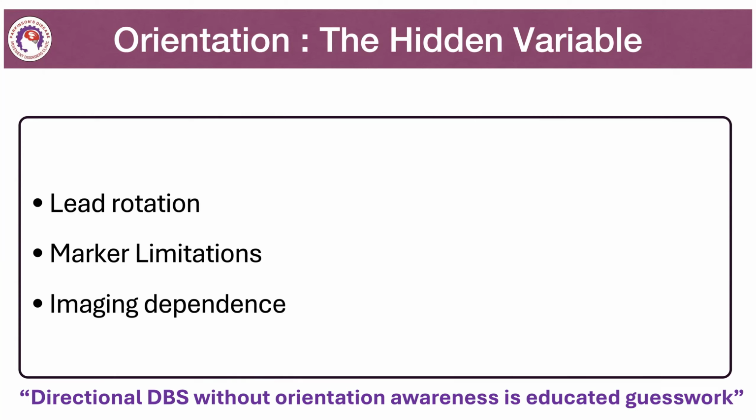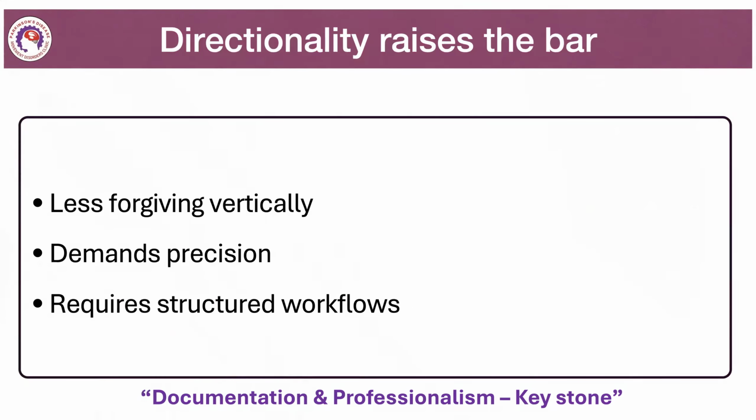So a lot of things go into the time of surgery and the post-surgery marking, to make sure that each contact you are looking at is in the right place, otherwise you're doing guesswork in managing your programming. Do remember, directionality raises the bar. It is less forgiving, and you need to spend more time. People tell you it may be easier, that you can quickly work around things with different types of programming. With straightforward programming, usually you don't need to work around.